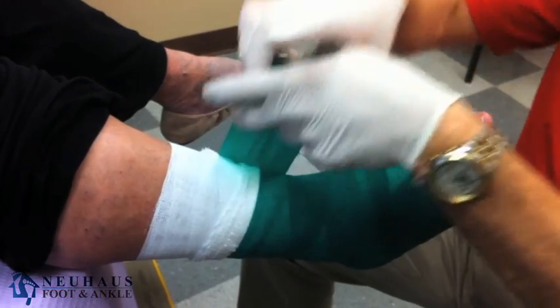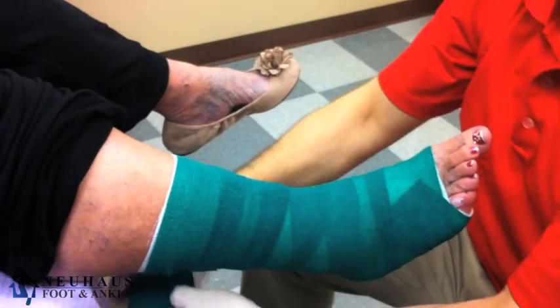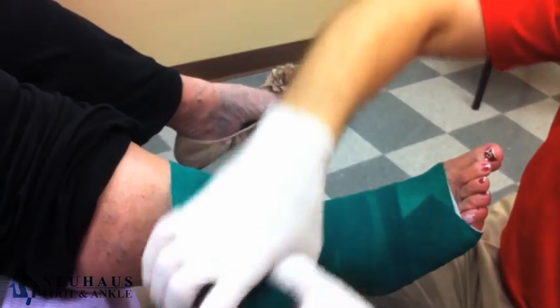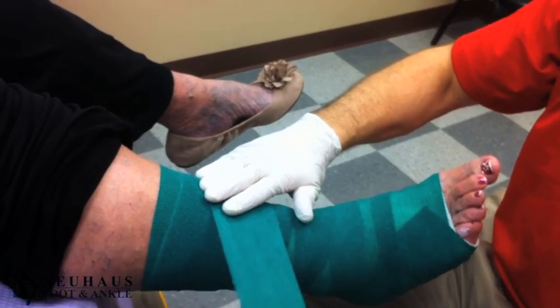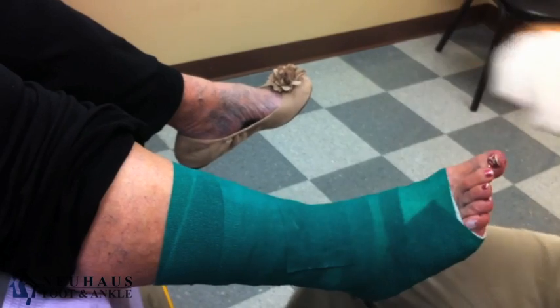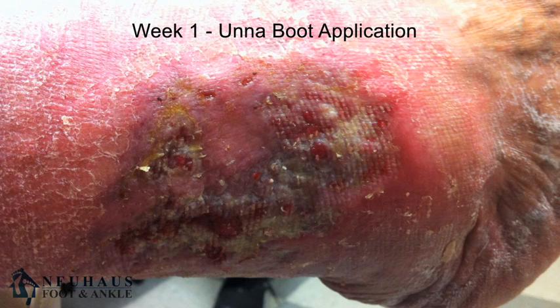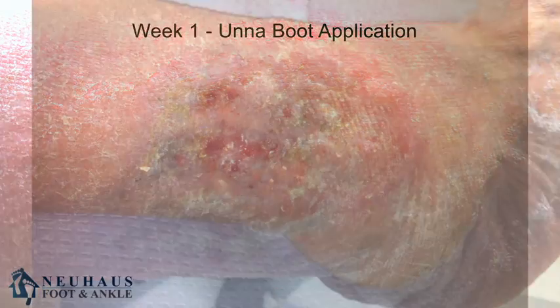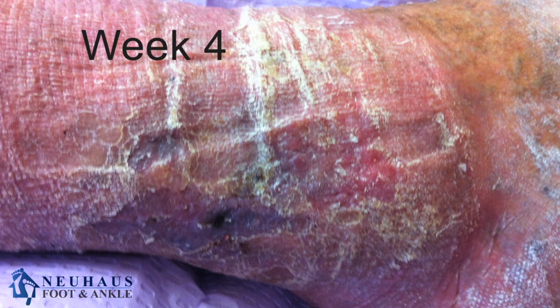We control the swelling and that allows the body to heal up the wound, and people do great with a problem like this. A wound of this size, which is about eight or ten centimeters, will take a few weeks to heal with several treatments like this. But we're able to get a wound like this to heal up without a lot of difficulty. I hope you can see from the pictures the progress we make between the before-treatment picture and the weekly pictures we've taken — treatment for a venous stasis ulceration with an Unaboot can be very, very successful.